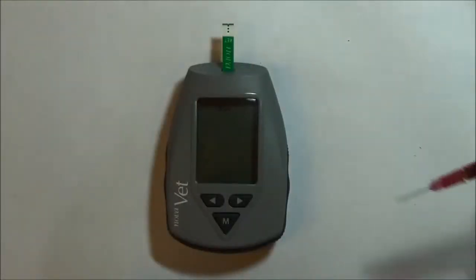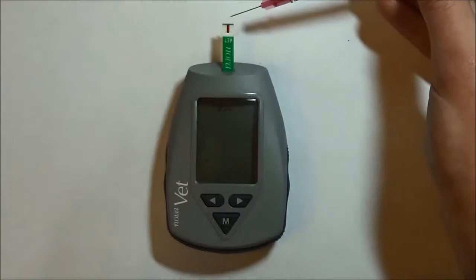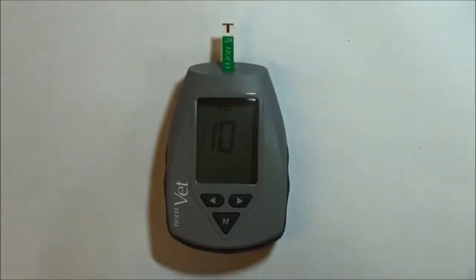Place 1-2 drops of the blood sample onto the end of the ketone test strip. The blood will be wicked into the test strip and analyzed. After 10 seconds, the screen will display the blood ketone level.